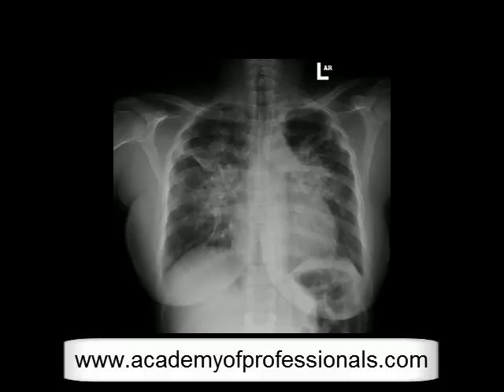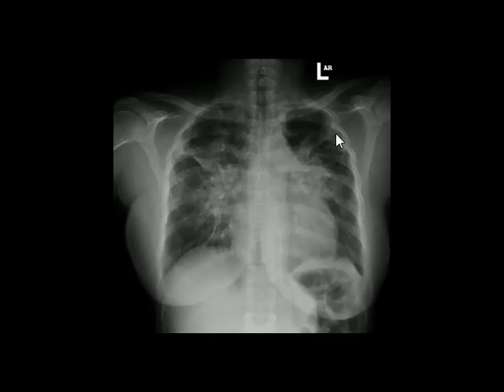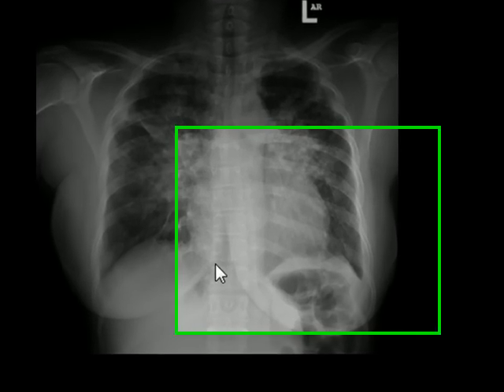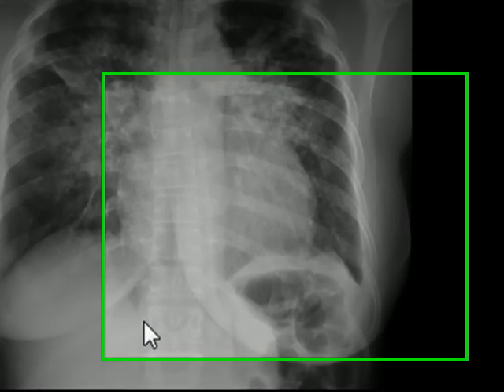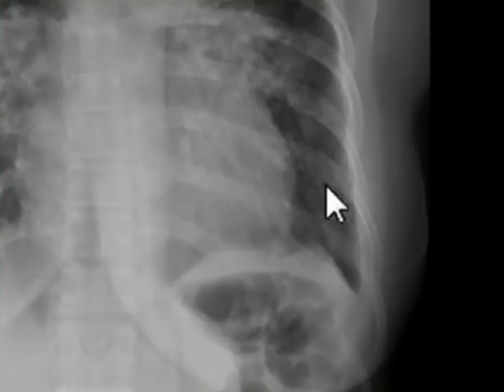We have seen this X-ray before — bilateral perihilar diffuse opacities, fibrosis, interstitial lines, and cardiomegaly have been discussed before, so we do not want to go there again. Have a close look at the left costophrenic angle.